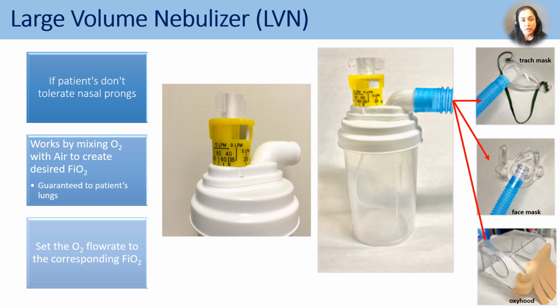And if you don't have a large volume nebulizer, a Venturi mask can accomplish the same thing without humidity. And then to note is that high flow cool aerosol used with face masks or oxy hoods or blow-by systems are no longer best practice for reasons of aerosol spread, and that they may not provide humidity levels you're looking for or the FiO2 desired.